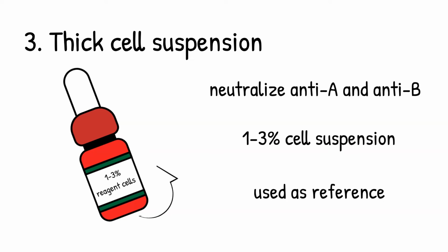You can mix the A1 cells bottle to a homogeneous mixture. That mixture is about 3% cell suspension. So compare the two solutions and make sure that it is about the same concentrations before using your cell suspension for ABO typing.